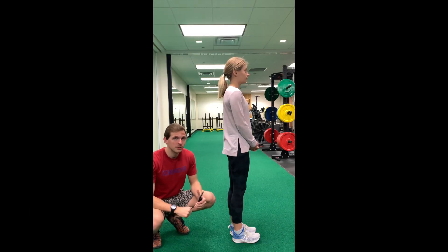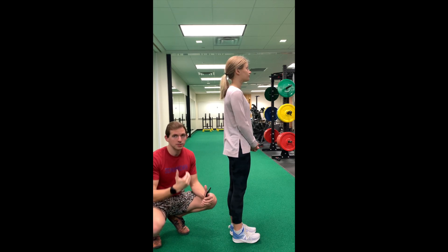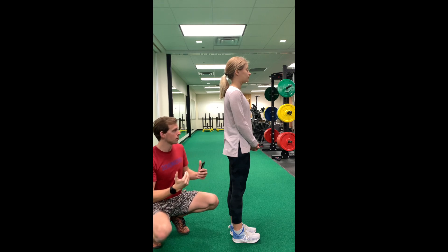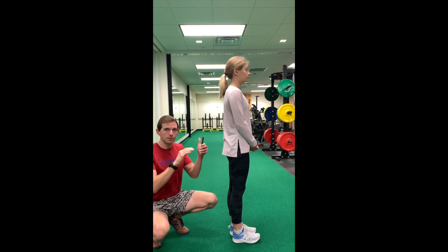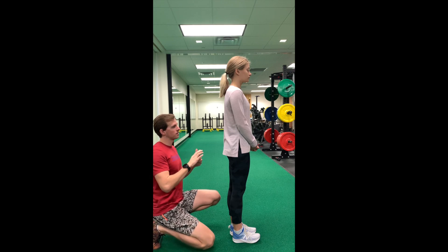All right, so now what I want to do is demonstrate how to use the inclinometer tool to measure lumbar flexion, extension, and side bend. First, what we're going to do is place the middle of the phone right around the T12-L1 spinous processes.